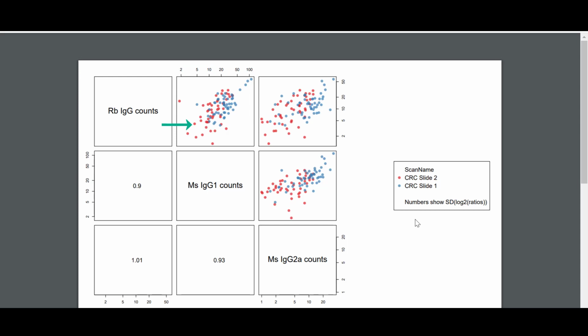Here we see an AOI with a rabbit IgG and mouse IgG count of around 5. Due to even mild variability, this AOI could have very well had a count of 6. This small one-count deviation, however, could change the normalization factor and thus the endogenous protein count levels in this AOI after normalization by upwards of 20%, which is quite significant.